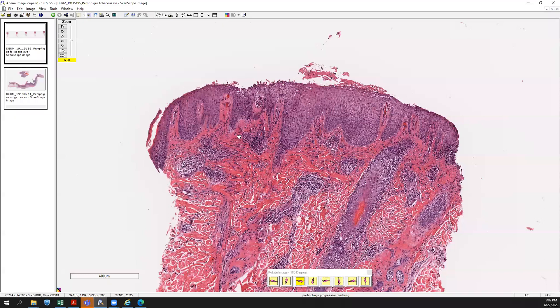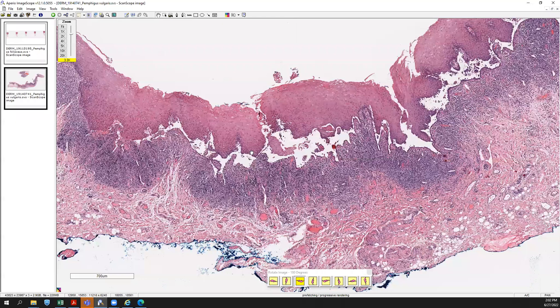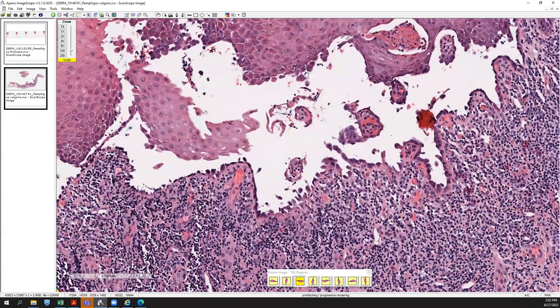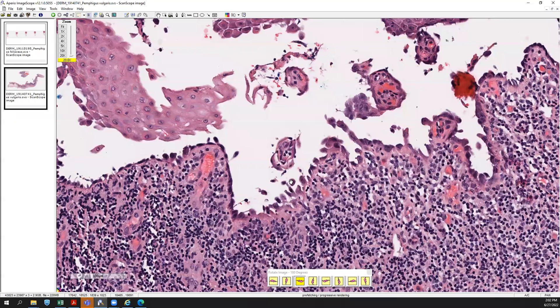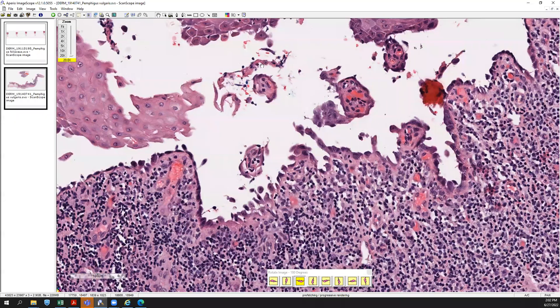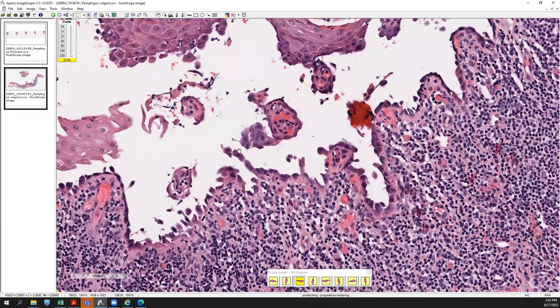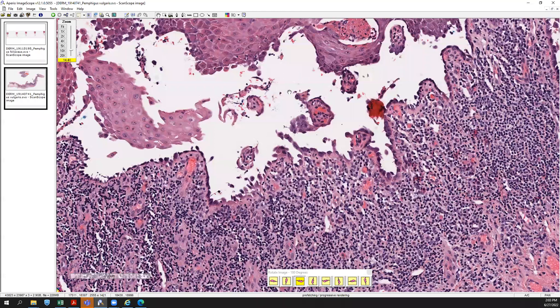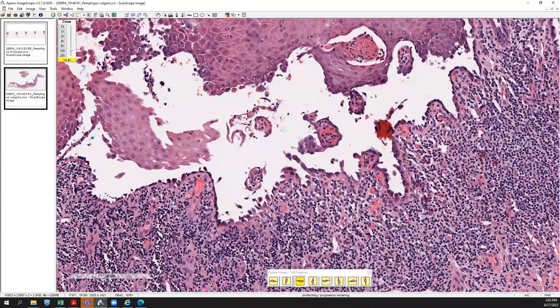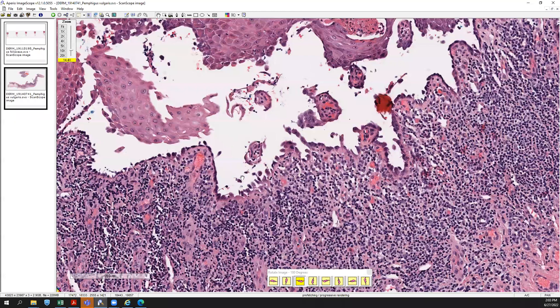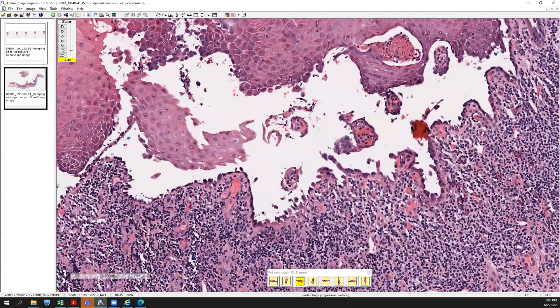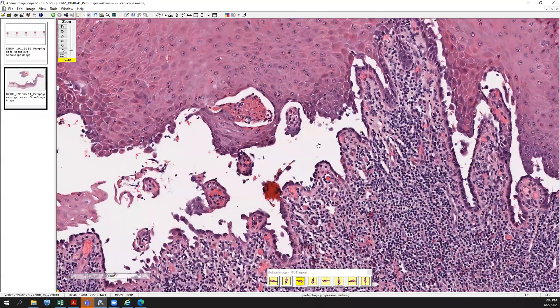Pemphigus vulgaris looks very different. It's not technically subepidermal — it's still an intraepidermal bulla forming — because you have a layer of keratinocytes still attached to the basement membrane that stick out like little tombstones. That's where you get the buzzword 'tombstoning.' You'll see intraepidermal acantholytic change; the cells are breaking apart because of anti-desmoglein 3, which is typically targeted. You can also have anti-desmoglein 1 and 3, but usually it's the anti-desmoglein 3 process causing this detachment and clefting at the bottom of the epidermis near the basal layer.